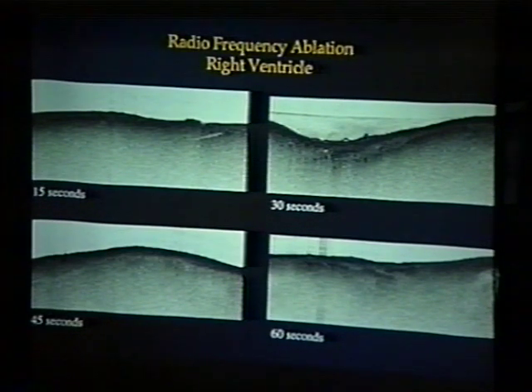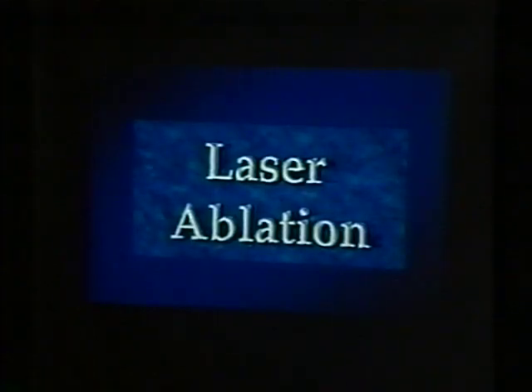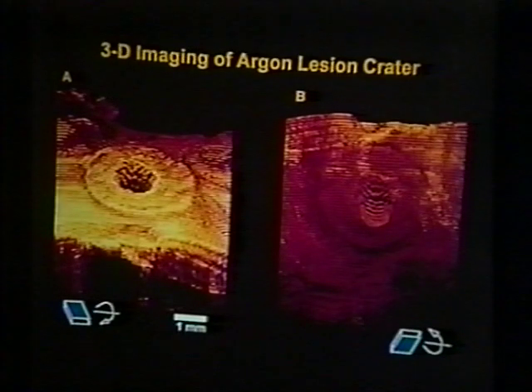Is that in vitro? These are in vitro, yeah. The rabbit aorta was the in vivo image from this series. So this is the right ventricle. We see an increase in backscattering intensity. And then the right atrium, where we get distortion of the tissue and decrease in penetration.